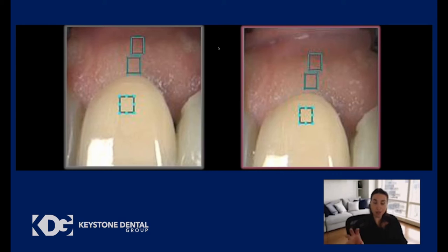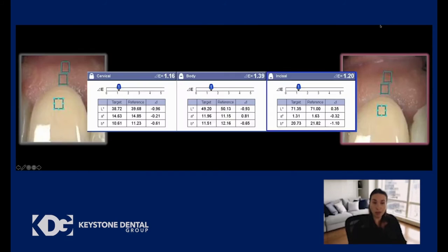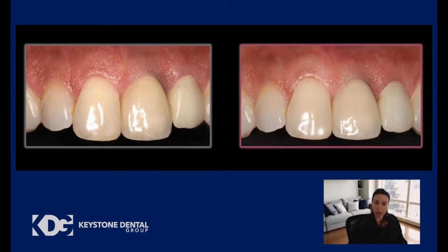So on the same patient with the thick tissue biotype, once we determined it was a thick tissue biotype, we evaluated the soft tissue color with a gray abutment that you see in the picture on the left and a pink abutment that you see in the picture on the right. And when we compare the color of the two of them, we see that the delta E between the two of them is very low. It's only 1.4. That means that it's not really discernible at a clinical level. This is the case that if I show you the gray on the left and the pink on the right, you may not be able to tell much of a difference. If putting a pink abutment is going to make a major difference in this case or not, it doesn't make as big of a difference.